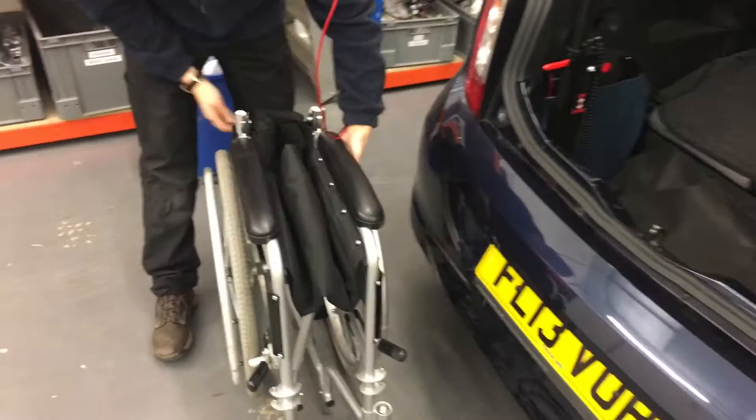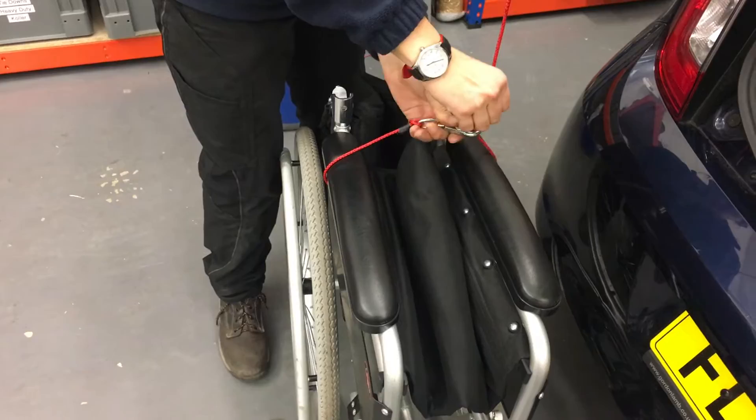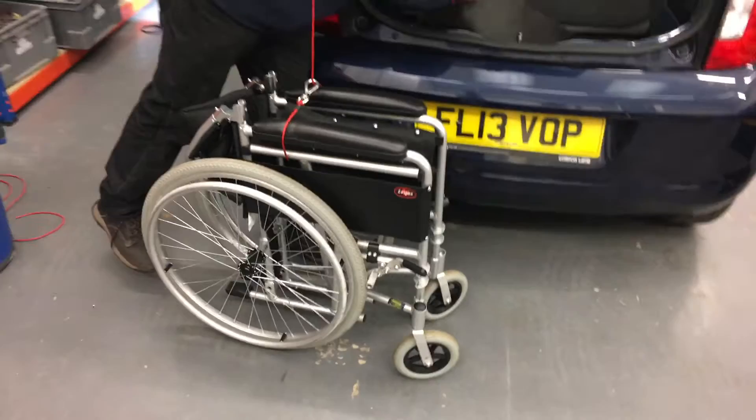Pass the cord around the wheelchair — that's quite important to get in position so the chair lifts level. It needs to be around about there on the armrests.